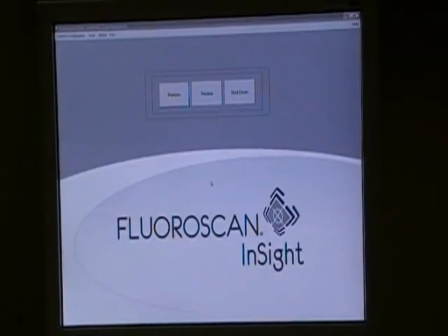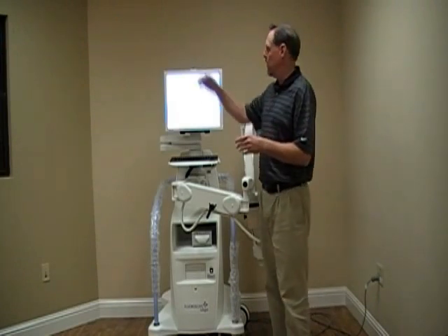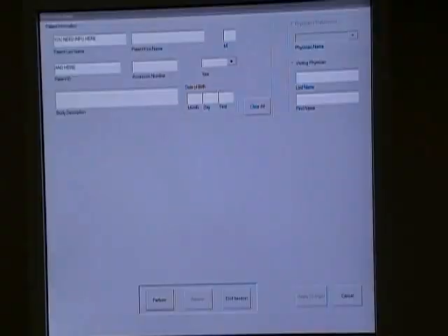On the screen we have Perform, Review, and Shut Down. We want Perform. It's going to ask you to put in your patient information. You need to put in a minimum of the patient's last name and the patient's medical record number, or the system will not operate.